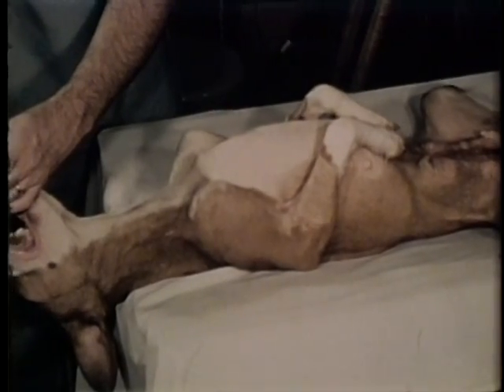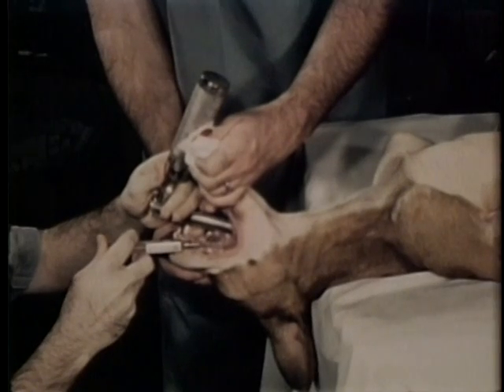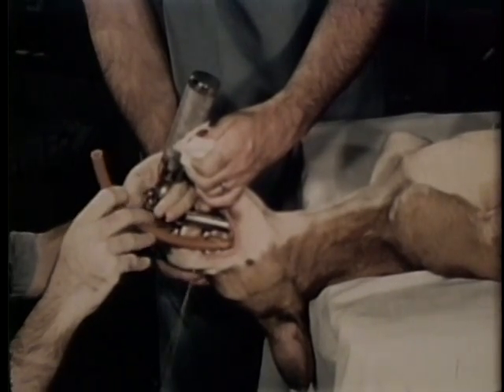The dog is immediately placed on his back, and the vocal cords are sprayed with 1% xylocaine in order to allow intubation of the trachea under light anesthesia. A cuffed endotracheal tube is inserted into the trachea.